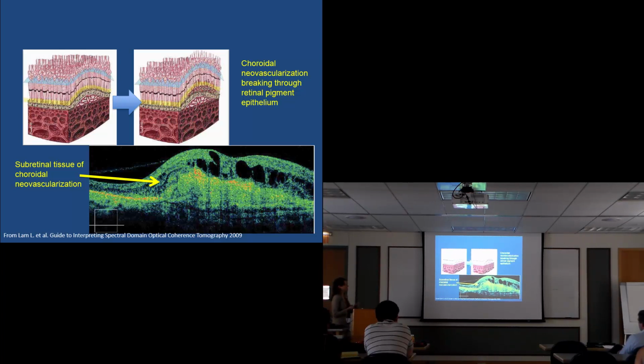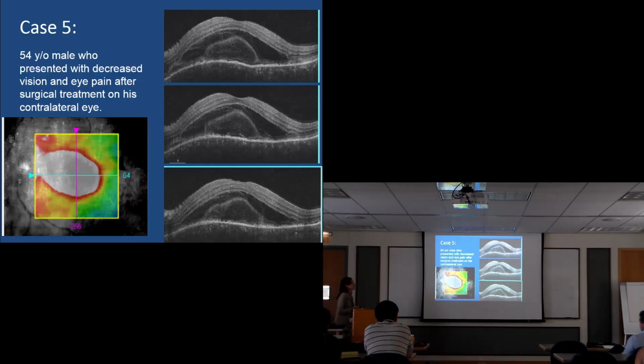This patient actually has had such long-standing disease that this elevation in the RPE permanently scarred this retina. These cysts are degenerative because there are no more photoreceptors left here. And so it helps us to guide patients, tell them what they have, give them prognosis, know who we should treat.